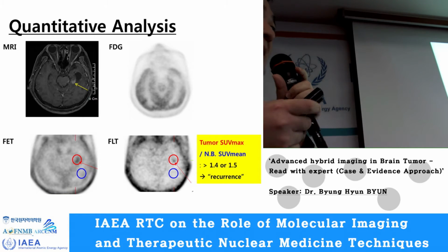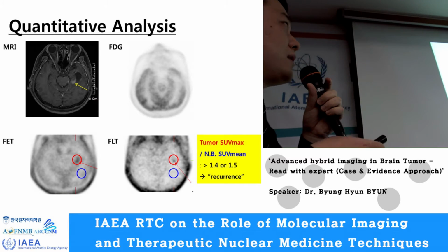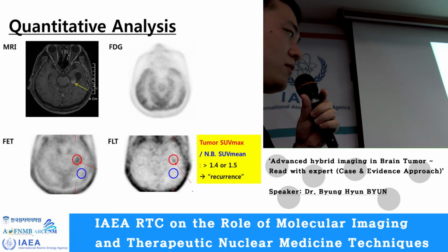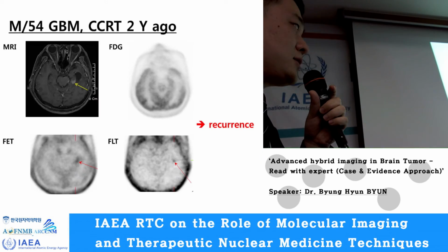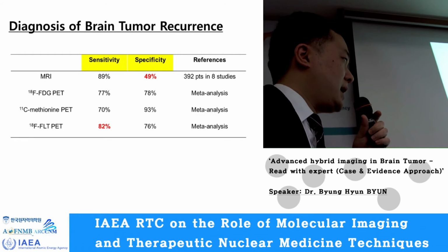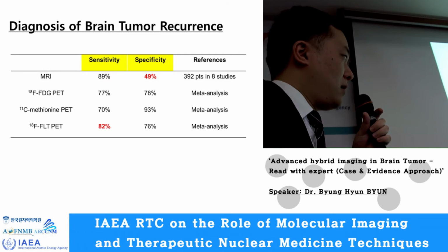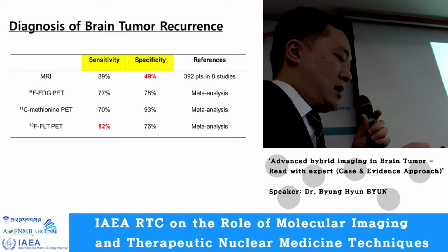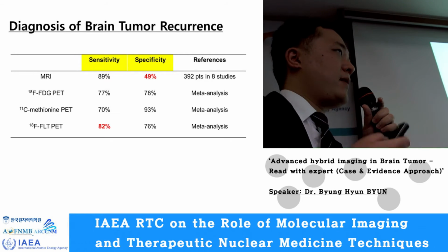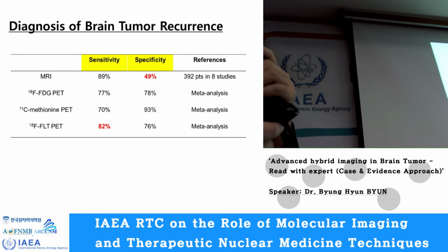Up to now, it is the best way or the most commonly used way for the quantification of tumor uptake on FET PET or FLT PET. Actually, the diagnostic accuracy of previously reported studies on methionine PET and FLT PET or FET PET are based on this method.